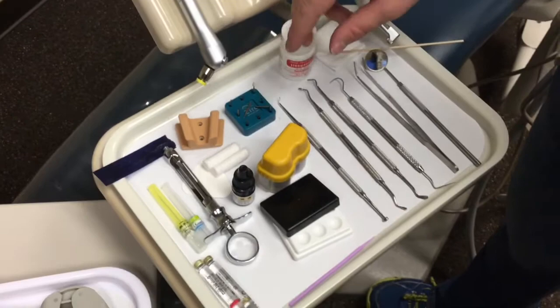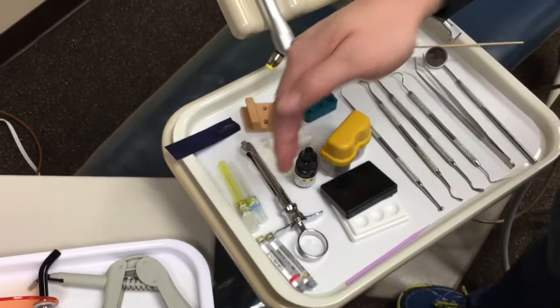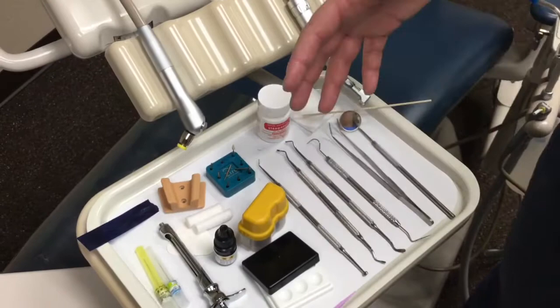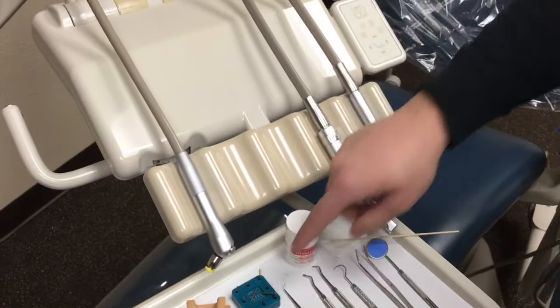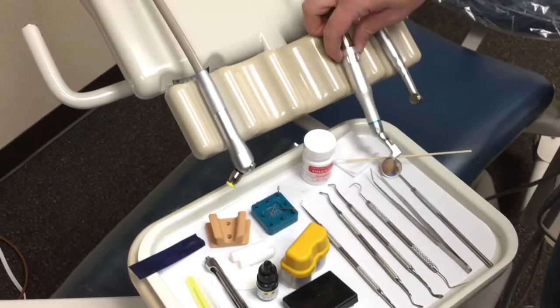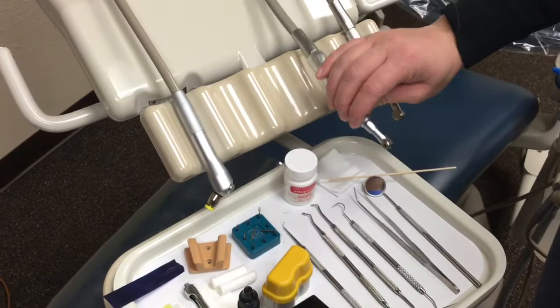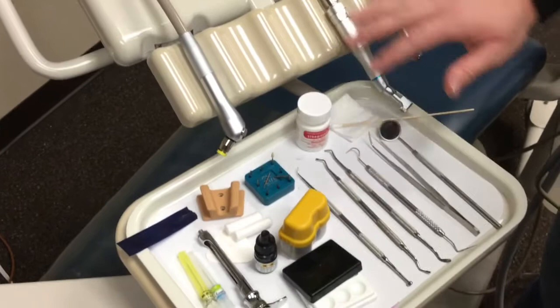After that, the doctor will come in and anesthetize, and we will rinse and suction with our saliva ejector and our air water syringe. Once the patient becomes numb, the doctor's going to start drilling. They typically start with their high speed, and most doctors will load up their own burs. Then for more defined refinement, the latch round number six is usually going to be used with the slow speed to widen out and get rid of the rest of the decay.